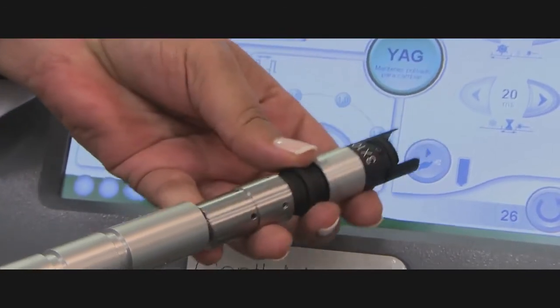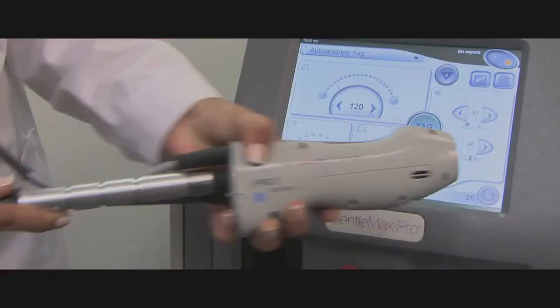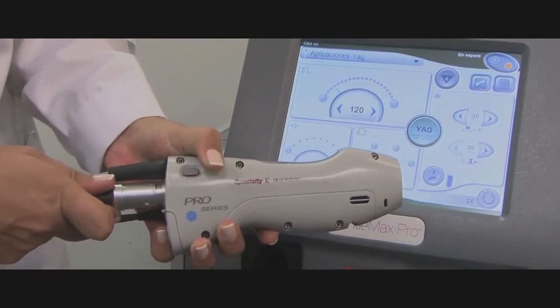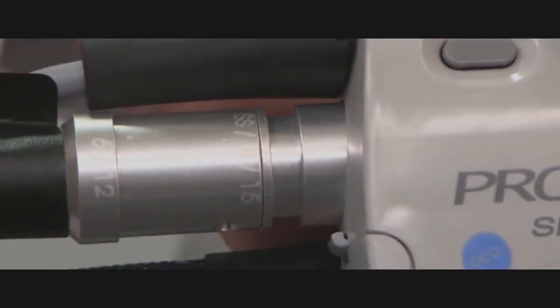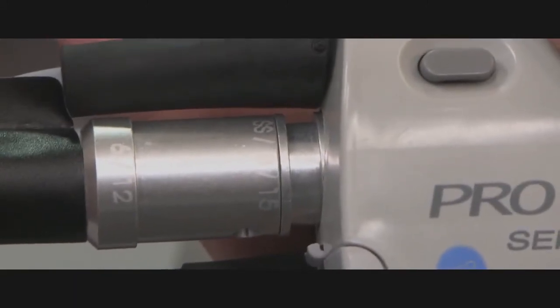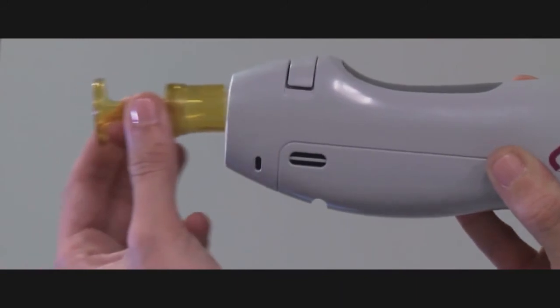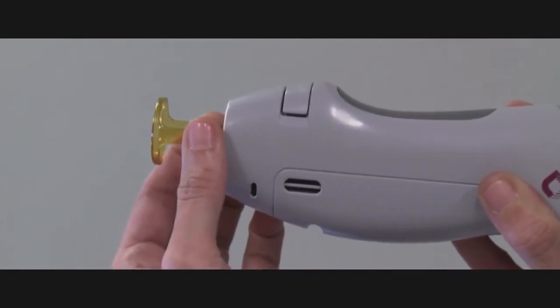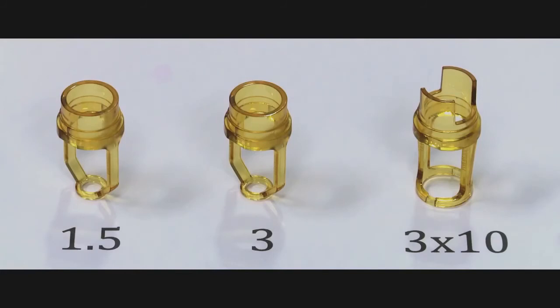Select the appropriate spot size slider attachment and attach it to the fiber. The slider is then inserted into the specialty handpiece until the spot is locked into place at the marking SS. The appropriate distance gauge is then attached to the end of the handpiece, depending on the spot size selected.